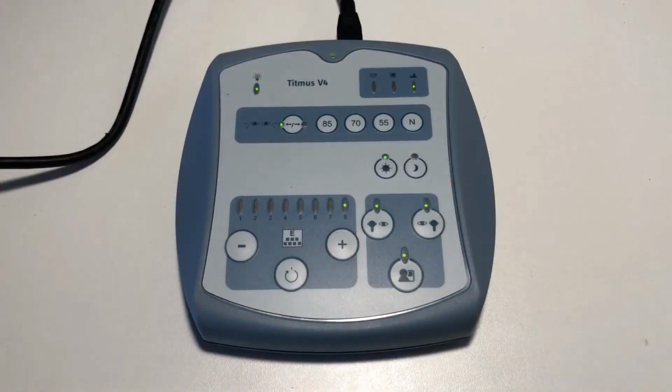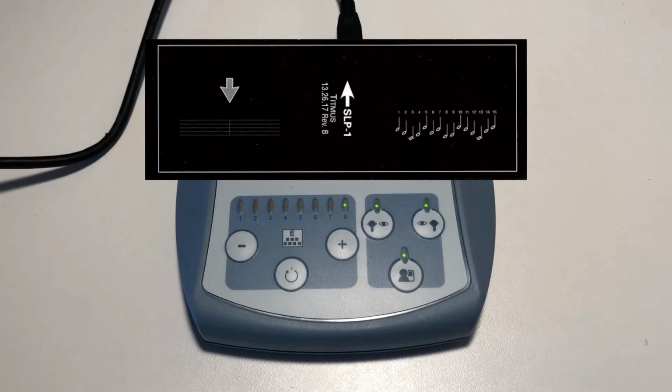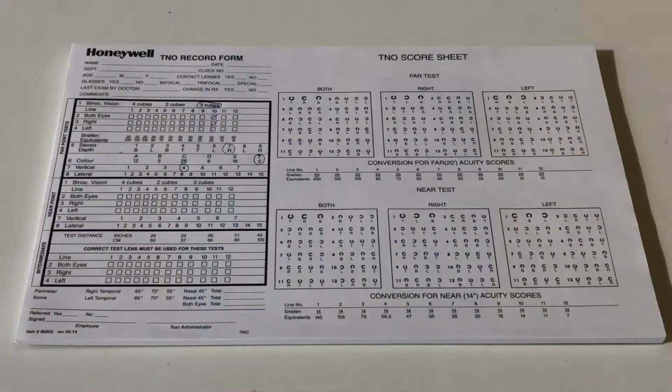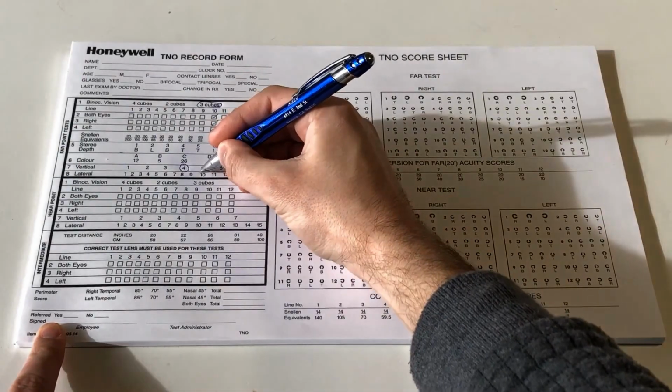Advance to slide number 8. This slide tests for horizontal phoria. Say to the patient, you should see an arrow pointing downwards to a musical note with a number. Tell me what number it's pointing at. Record the number on the record form.